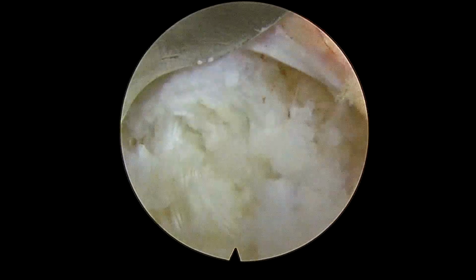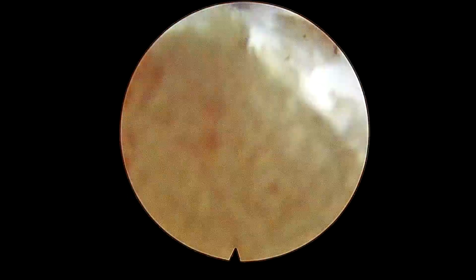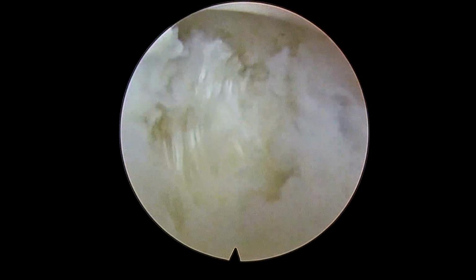So we have completed our annular work. We have done annuloplasty. We flattened the annulus here. Now I am going inside the disc to remove the soft disc fragments, free disc fragments which are lying inside the disc.